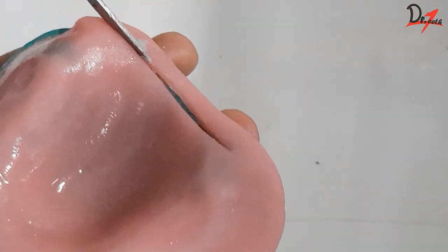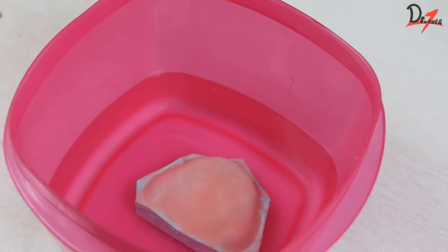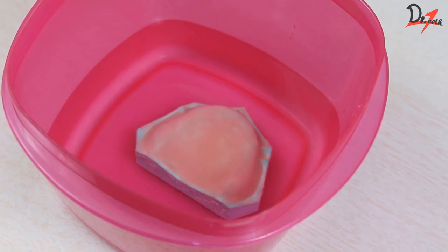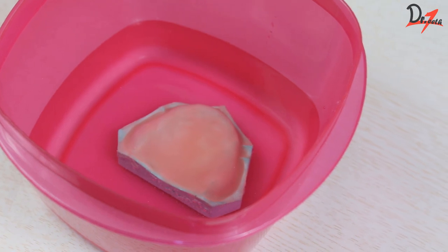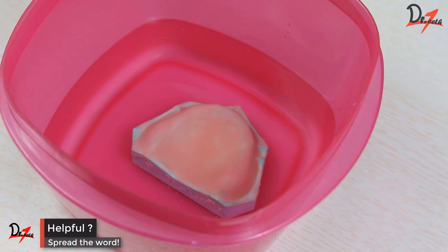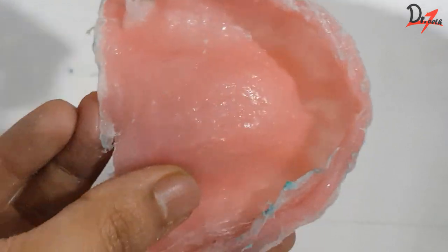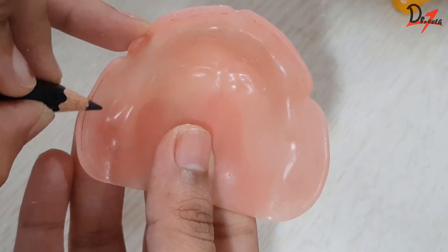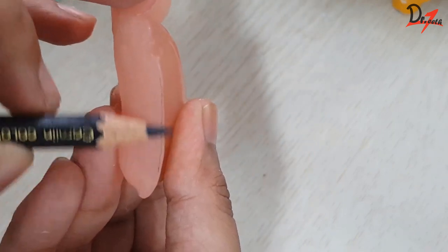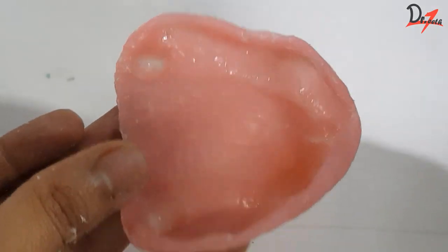We will cut off the excess material after we are satisfied with how it looks. Make sure you keep it immersed in water until the polymerization happens — if you do not, you will again have chances of getting those opaque rough blotches. Then we will remove it and trim it. You can always mark the internal and external boundary of the record base using a pencil to visualize the flange width correctly and get a uniform width.